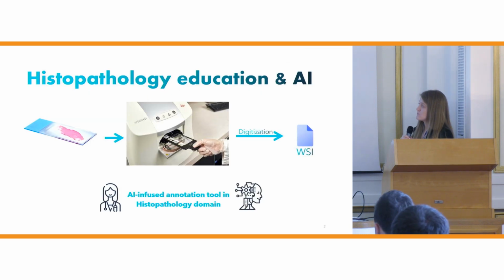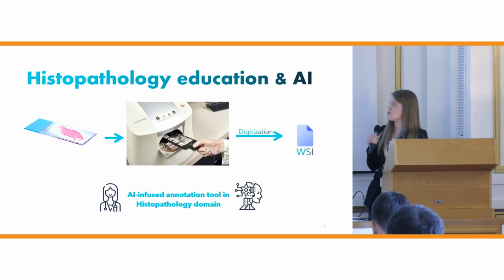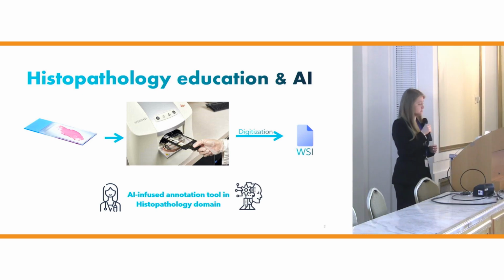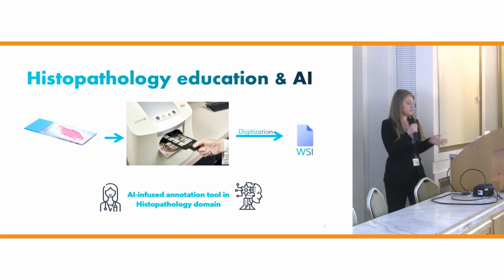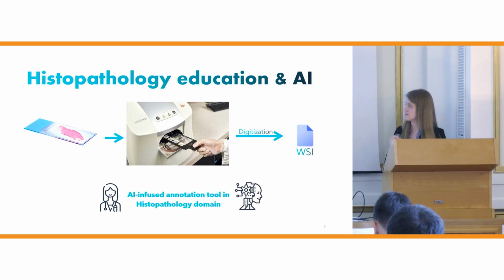First of all, it's really important to mention that our research is in cooperation with domain experts from the histopathologic field. And we found out that some of the processes are really old-fashioned and unnecessarily time-consuming, especially when we are talking about observing the specimens. As you can see on the slide, the specimen is a sheet of glass with a really thin and small piece of tissue with special chemical coloring. As I mentioned, it's observed by microscope.